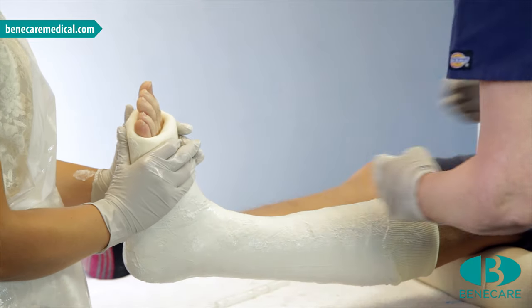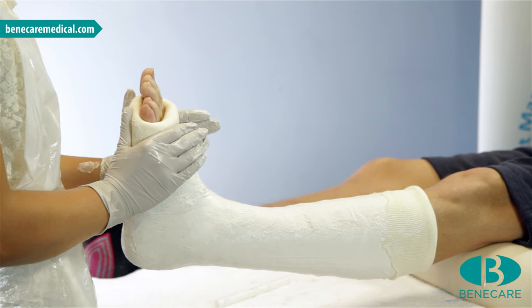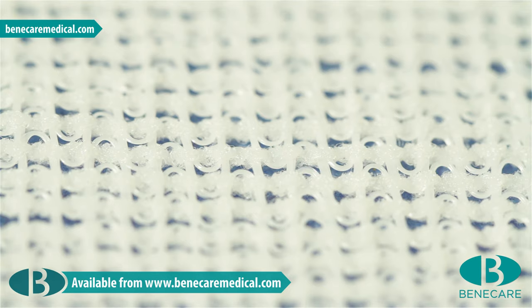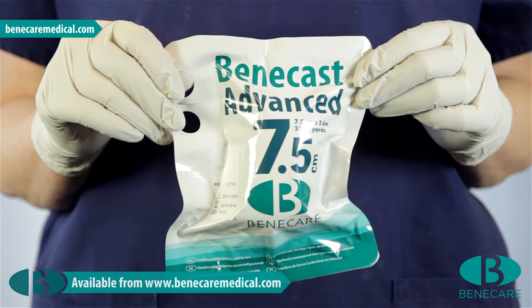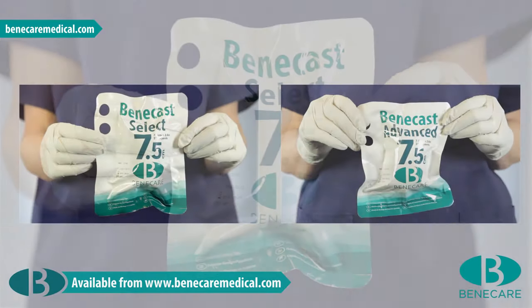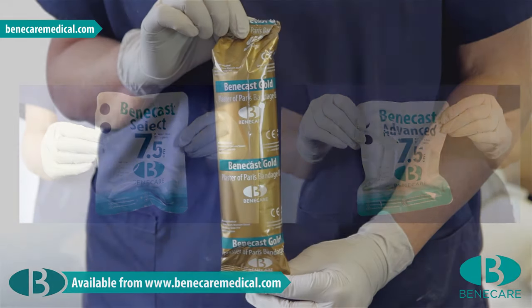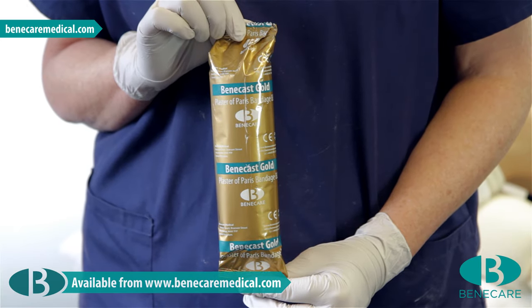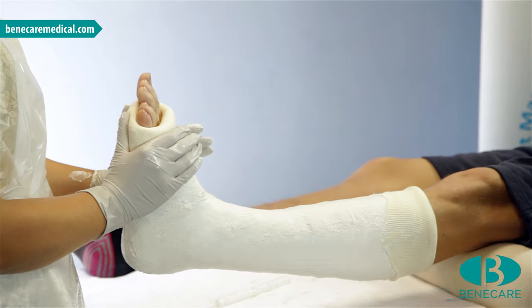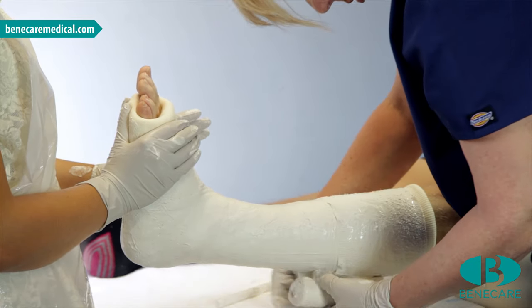Ensure there are no rough edges and that all the toes are exposed and the knee can flex to a minimum of 90 degrees. Depending on the indication, synthetic casting material such as Benecast Advanced or Benecast Select can be used at this stage to complete the cast and produce a perfectly moulded, very durable combi cast. However, if continuing with POP, take the third roll and repeat as you did with rolls 1 and 2, starting slightly lower to maintain the soft edge and capture the end of the stockinette.